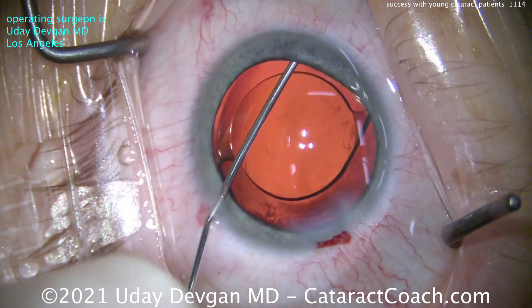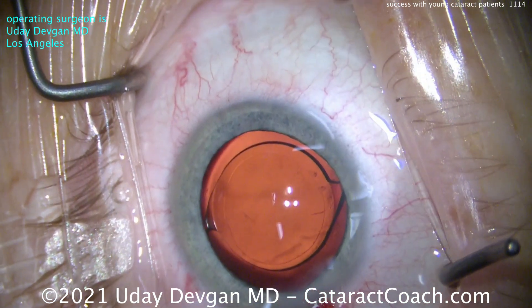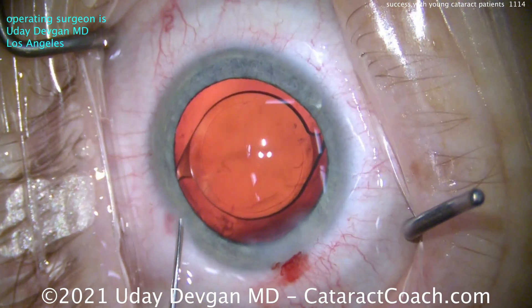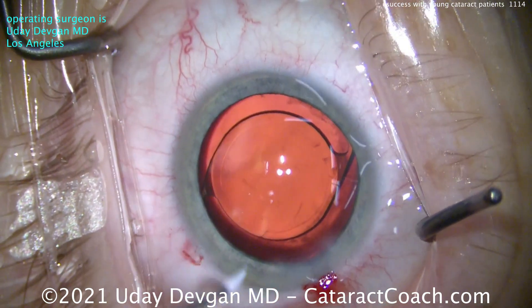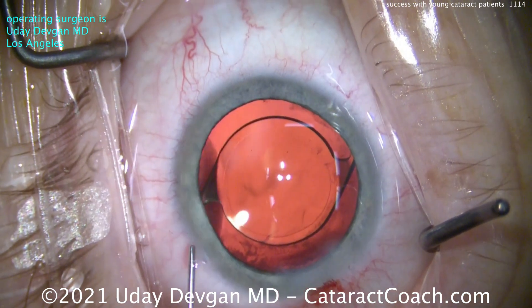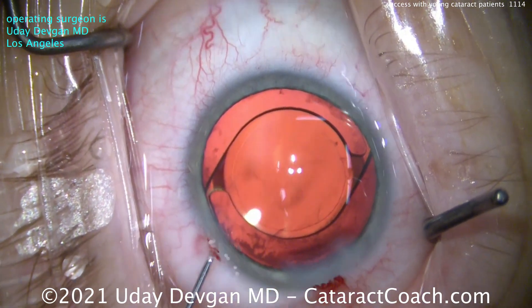Here at the end, you can see the lens in beautiful position. We're fixing that reverse pupillary block — very common in myopic eyes — and look at the rhexis overlap: beautiful. That is a 5-millimeter capsulorhexis overlapping that optic very precisely, 360-degree overlap. That is what you want. Remember what I told you — what's your signature? Your incision and your capsulorhexis are what everyone will see for the rest of this patient's life. When anyone looks at this eye, I am super proud to say I did that rhexis and I did that incision, and that is a beautiful outcome. The lens is perfectly centered.